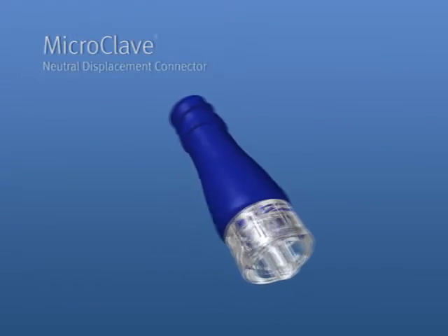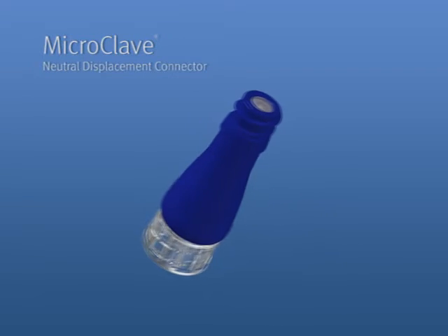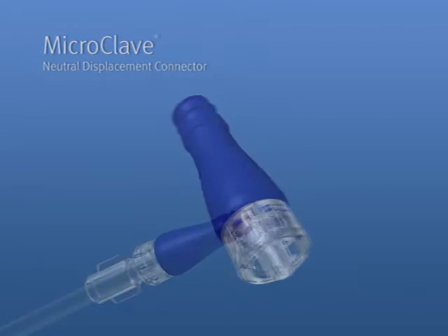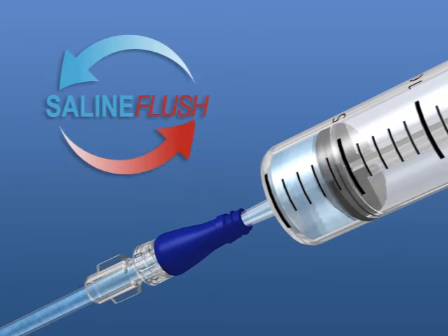The Microclave is the latest in connector technology by ICU Medical. The Microclave is built on the same landmark design as the original Clave, yet meets the additional demands of health care today with neutral displacement and saline flush.